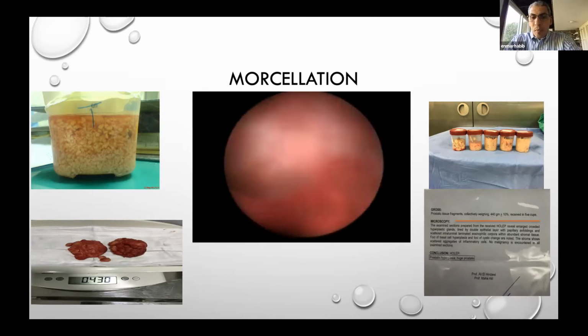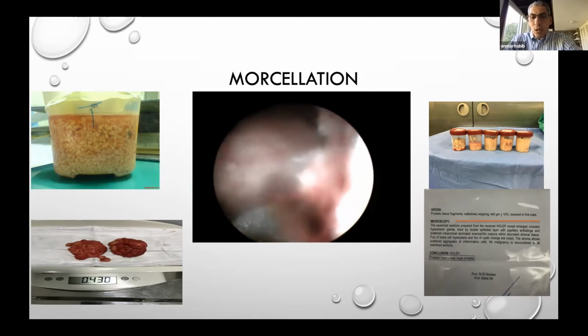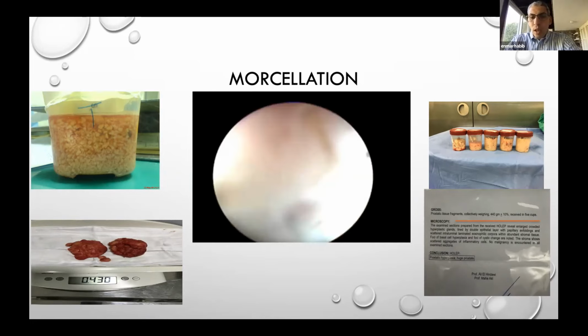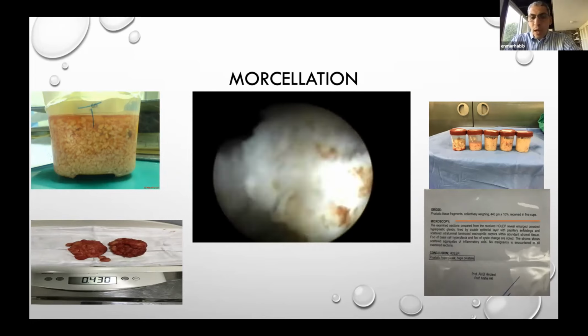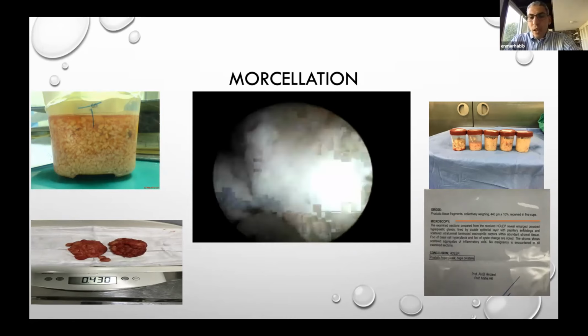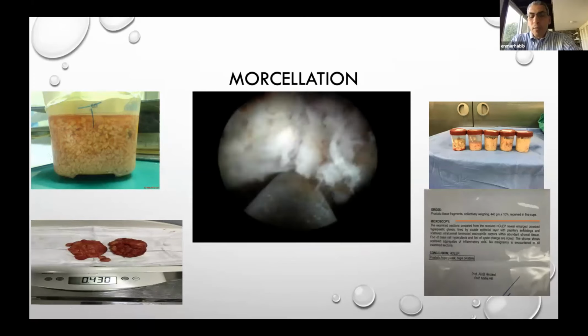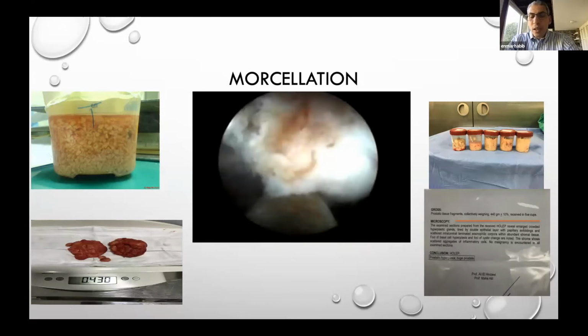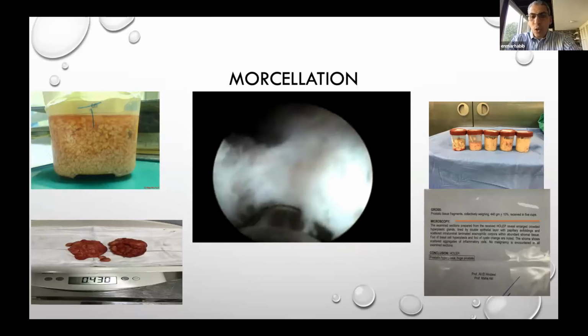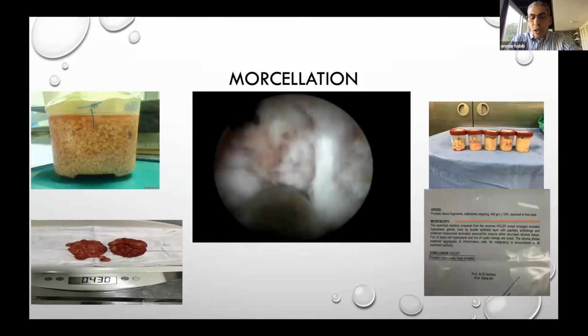So there are some tips and tricks to protect the bladder in morcellation. I'm using a Versa cut morcellator. This morcellator works in a reciprocating action. There are other types of morcellators that use an oscillating action. So you remove your resectoscope and keep the outer sheath of the resectoscope, and you add your regular long nephroscope, the one used for PCNL, to morcellate in the bladder.